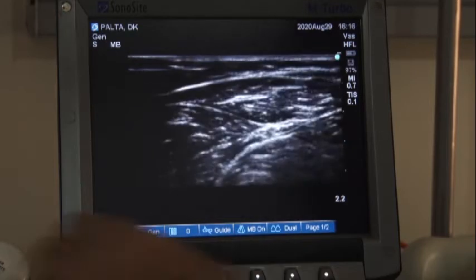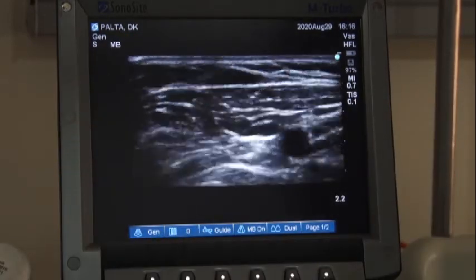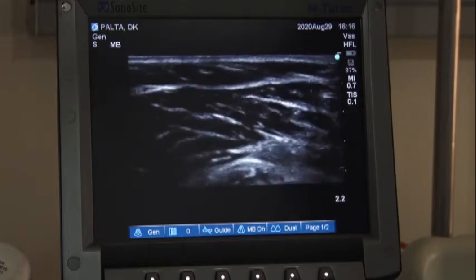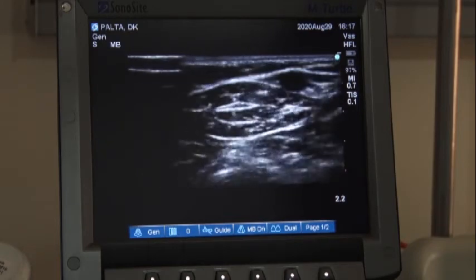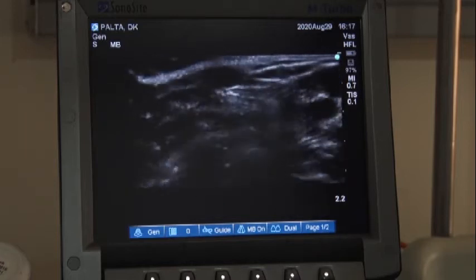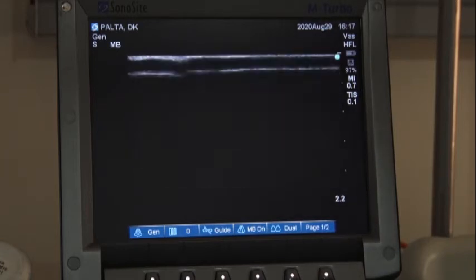One is going, this is again, there is one more vein, this branch. This is the main vein, this again joining the median cubital vein, then breaking into two, the cephalic vein of the arm and the basilic vein of the arm.